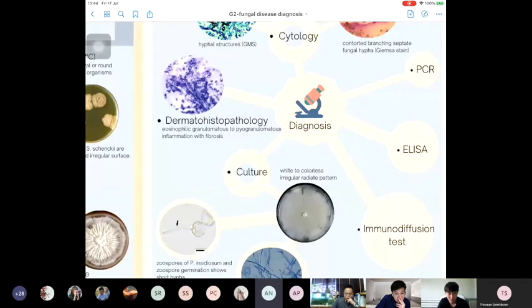The definitive diagnosis of pythiosis has been challenging because histopathologic features are not specific, and the organisms are not often successfully cultured. For PCR analysis, fungal isolation and tissue samples were submitted to amplify the regions of ITS1 and ITS2 by using polymerase chain reaction. The DNA sequences of amplicons from both samples show identical 891 bp ITS region. The phylogenetic tree was generated using neighbor joining analysis based on 10,000 replicates of bootstrap.